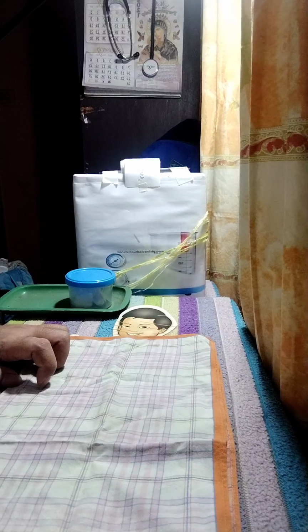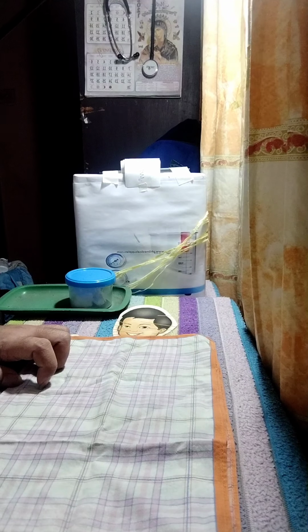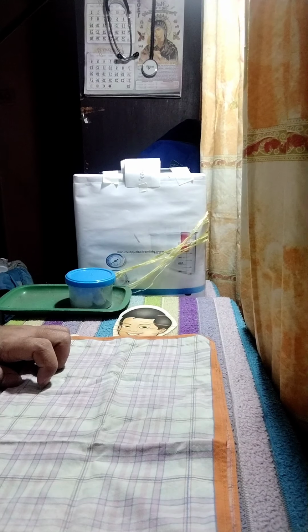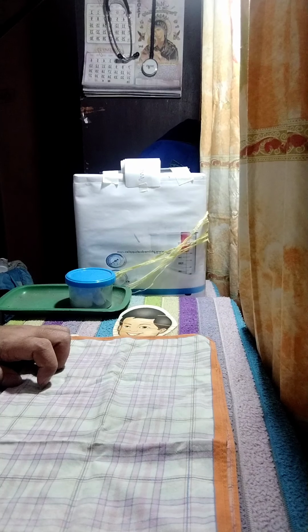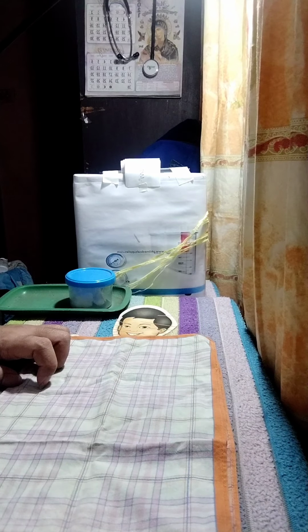For implementation, have the patient lie in supine position in the center of the bed with the arms at the sides. Raise the head of the bed if necessary to promote comfort. Expose the patient's arms and legs and drape the patient appropriately.